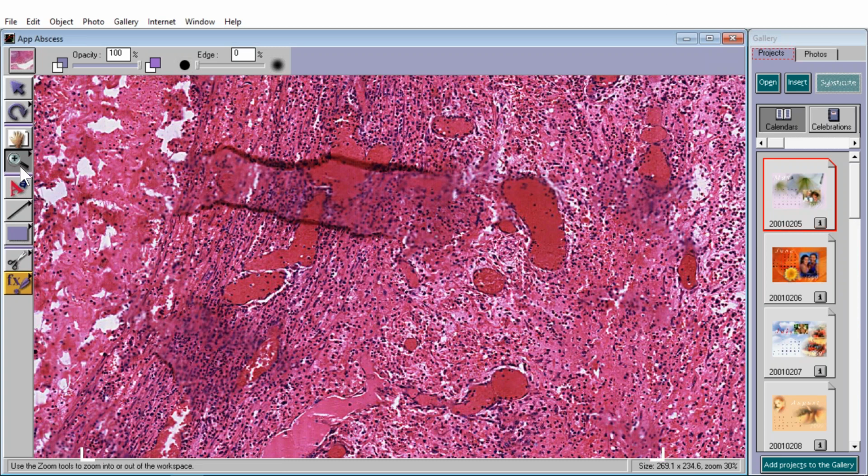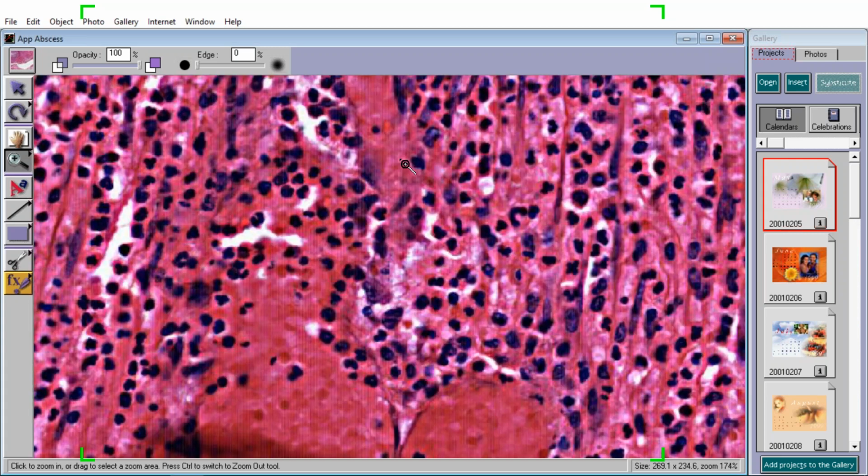Now, I know what you're thinking. You're thinking, well, why is he calling them acute inflammatory cells? How do we know those are neutrophils rather than lymphocytes? Well, there's a reason for that. But here, take a look at the majority of these cells.